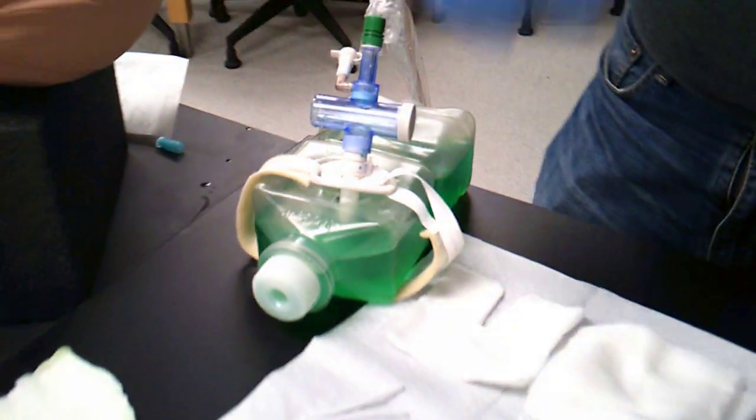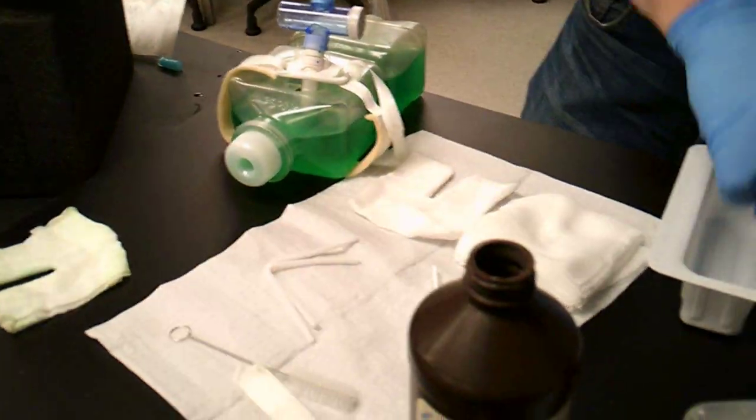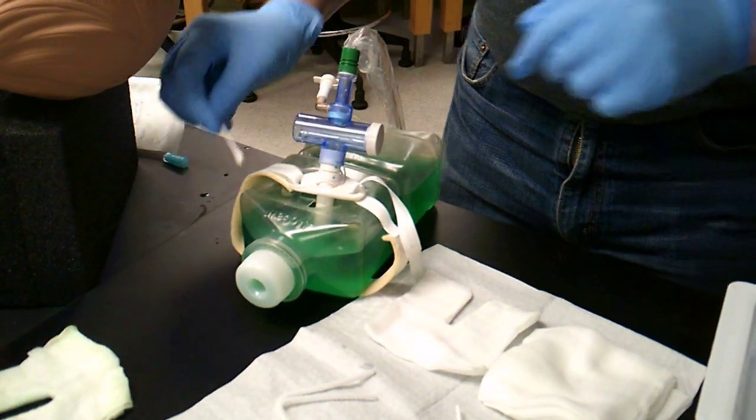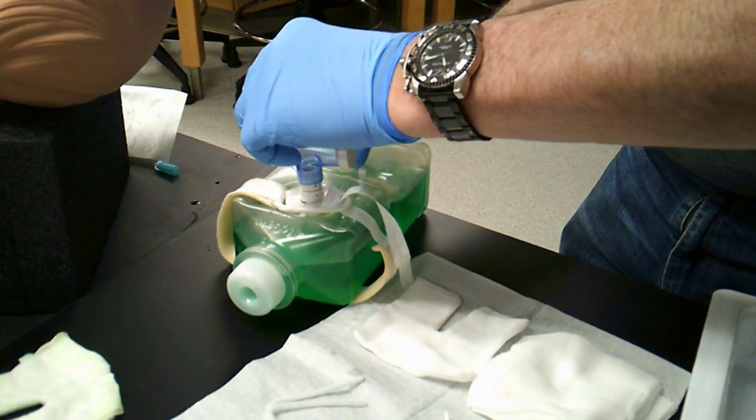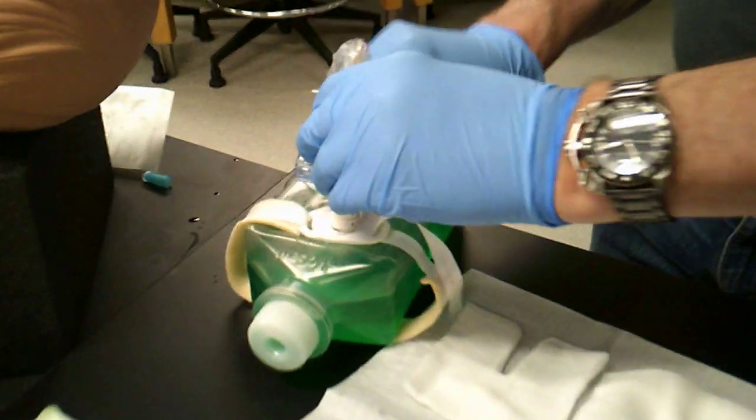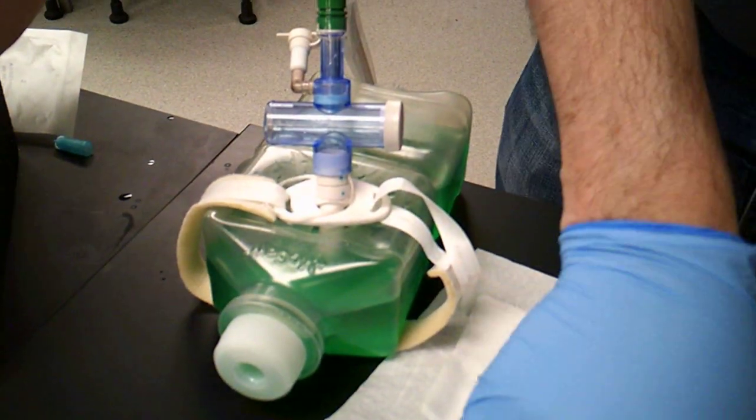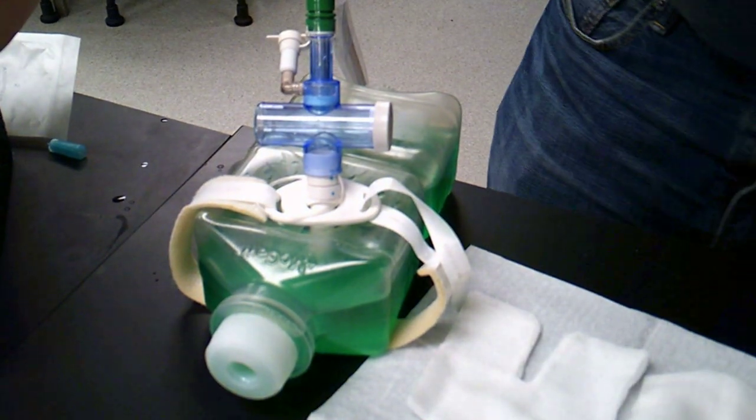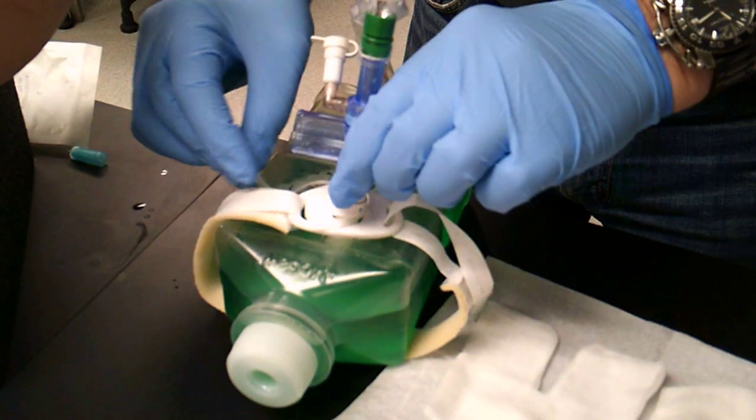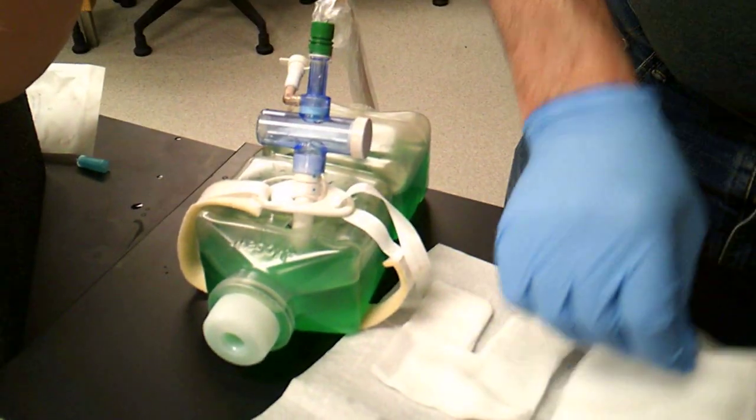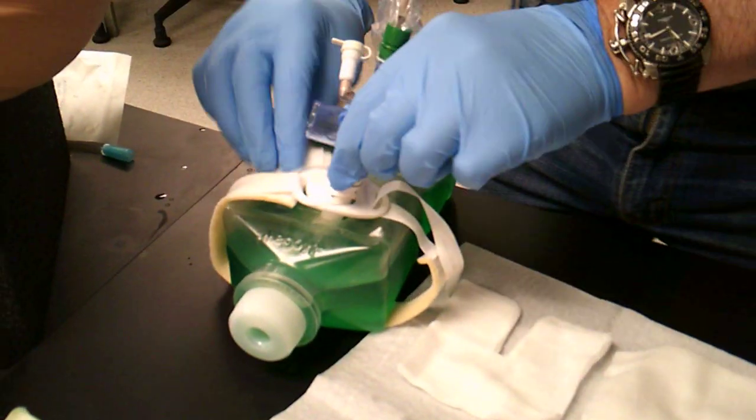And I'm going to go ahead then and do some cleaning around, always cleaning away from the trach tube itself. I'm going to take, do some cleaning, rinsing it, and taking this and just drying it off.